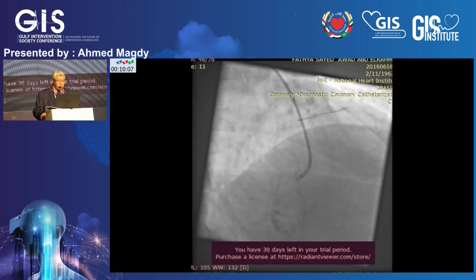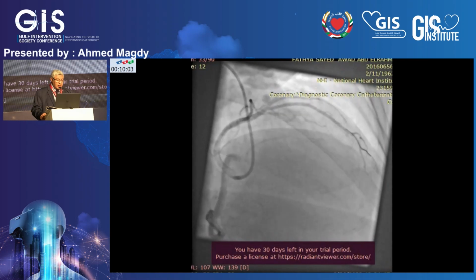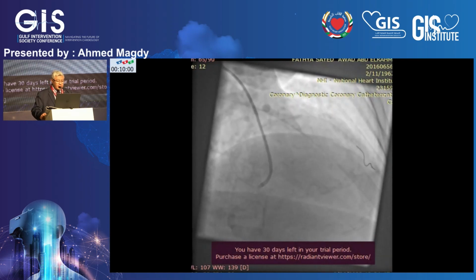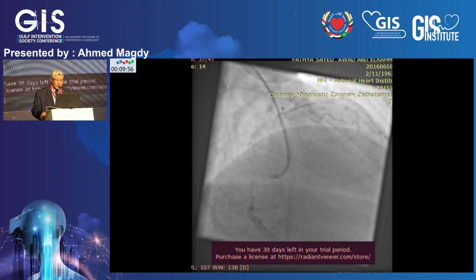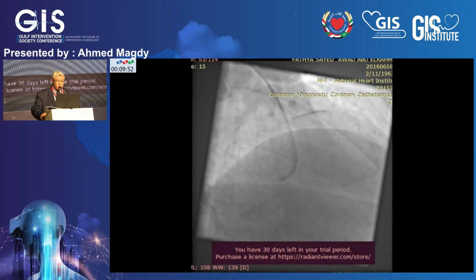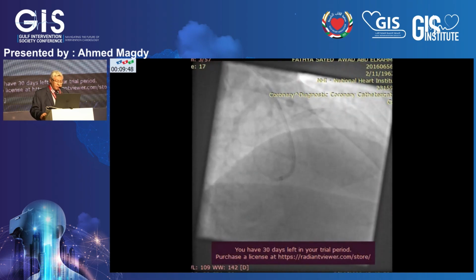But finally, we were able to put a stent in the LAD and in the ostium of the CX. Of course, I may require imaging, but having this case with little support, it's difficult. So we did the 2 lesions peacefully.